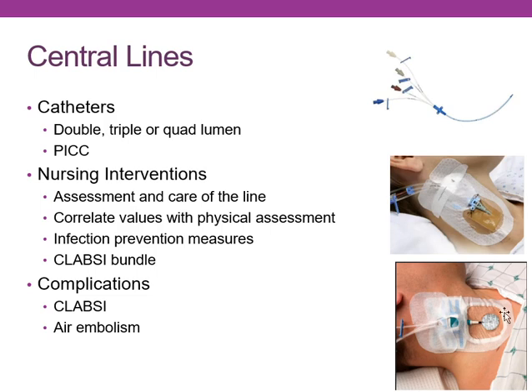Here's 2 different IJs. We've already talked about why we like IJ. This is that Tegaderm with that chlorhexidine in it. You can kind of see that little rectangular patch there. This has a BioPatch. Those look like really great dressings. If my dressing's not intact, I need to remove that. These are sterile. If the dressing's not attached, we need to attach it.